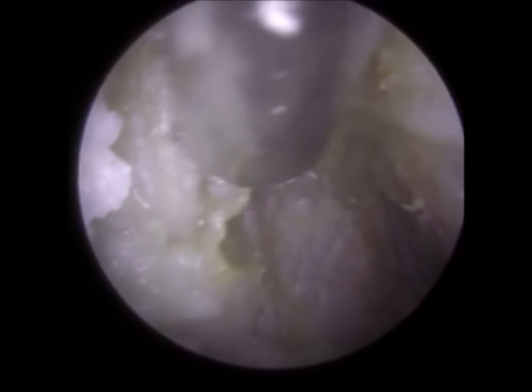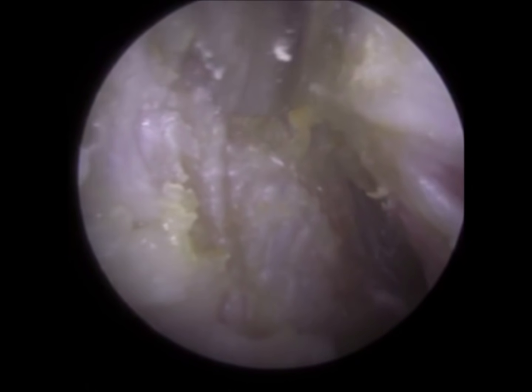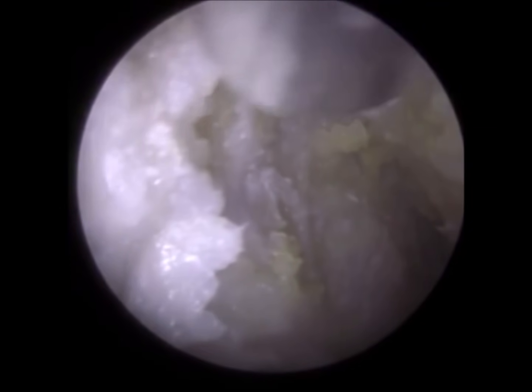You've got someone's eardrum, so if I'm approaching a thin layer of dead keratin on someone's ear that's stuck on the eardrum with a pair of forceps that's pointed, I'm going to poke through the eardrum. I thought that would be kind of self-explanatory and a bit of common sense, but for some people clearly not. Anyway, if you want to watch that video, I've left a comment there.